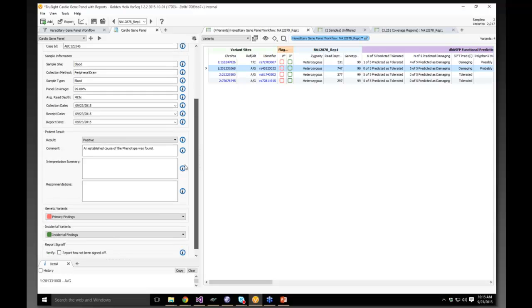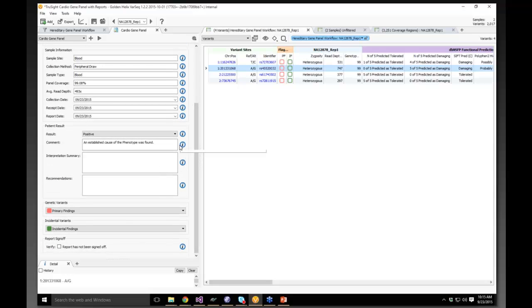So in this case, and this is the critical interface of what the hands-on human experience is, we need to say which of these variants do I put in my report, and what's the final result? Is it a negative finding? No variants conclusively supported it. Notice we can actually have report components be responsive to the input here. So let's say we find this to be a primary finding. And we're going to select our red check boxes to go into our primary findings section, and our green check boxes here go into our incidental findings. And this gets rendered into the report.